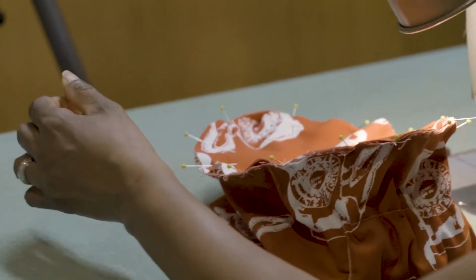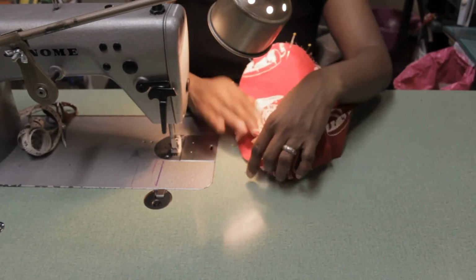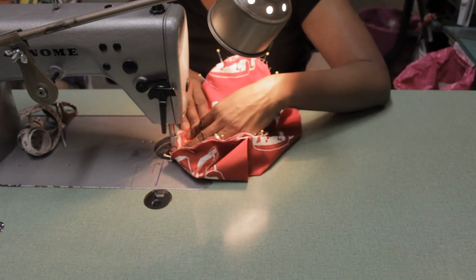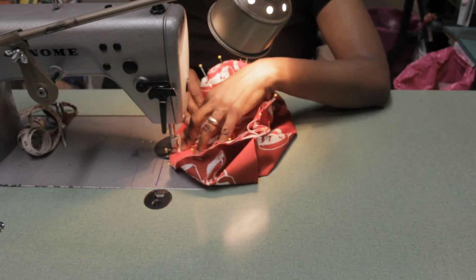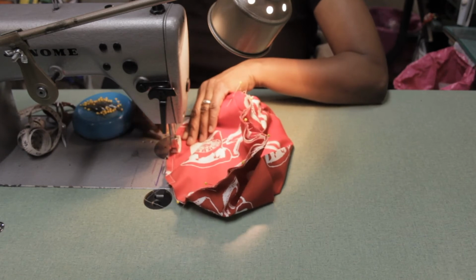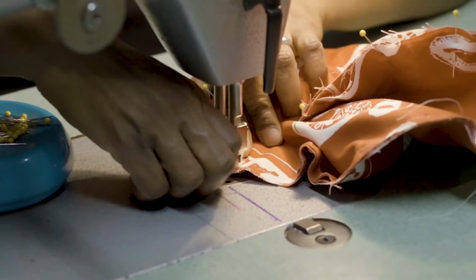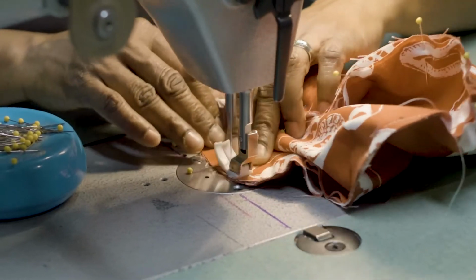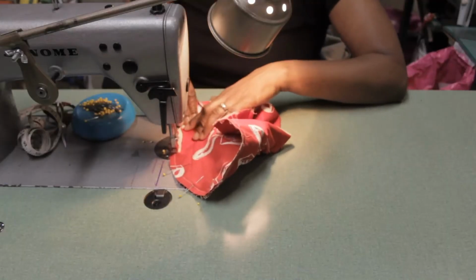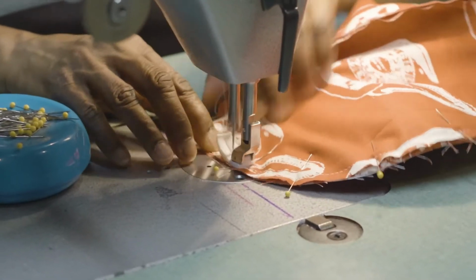Okay, so I've got it all pinned, as you can see, and now we are just going to sew this together. The best way to sew it is to sew it so that your band is on the bed of your machine and you're sewing from the top. And we're going to sew a 1/4 of an inch seam allowance again. So we're just gonna go around. I sew over my pins. I take that chance. If you don't want to, you can take the pins out just before you get to them. Take your time, sewing around 1/4 of an inch. Again, making sure that you're not getting any puckers.